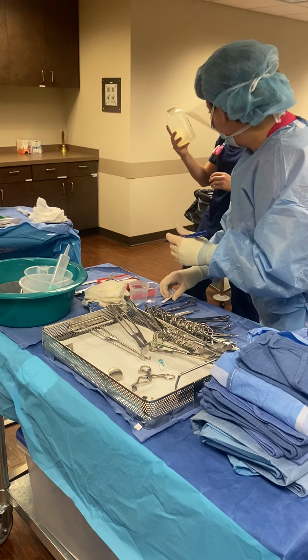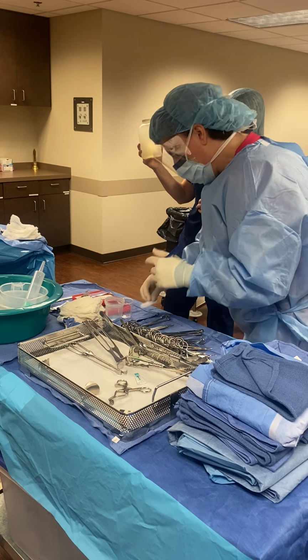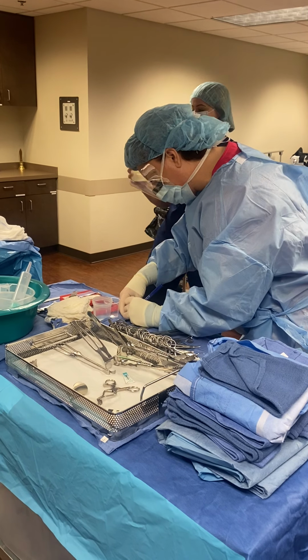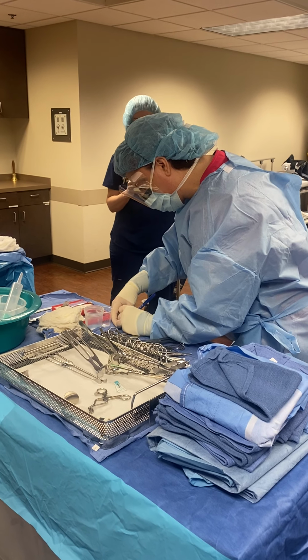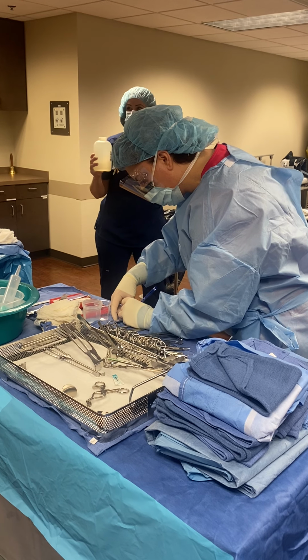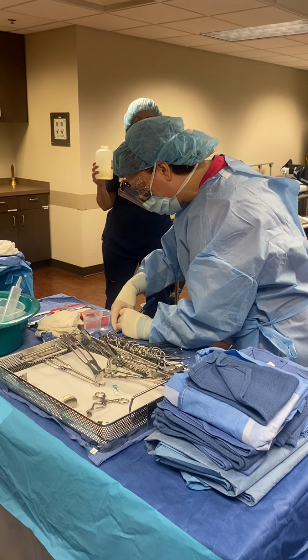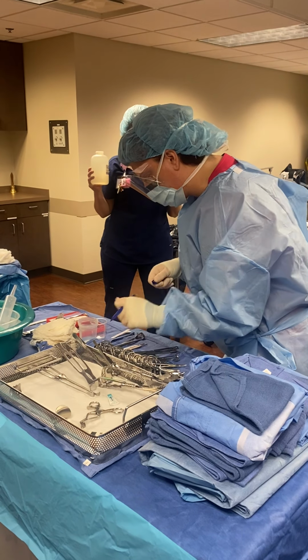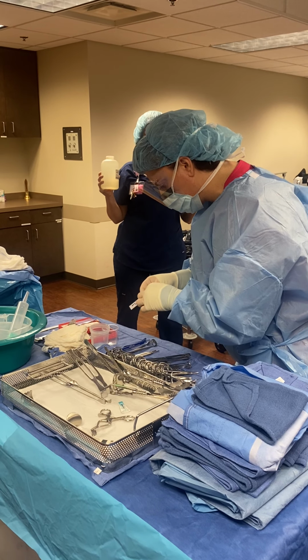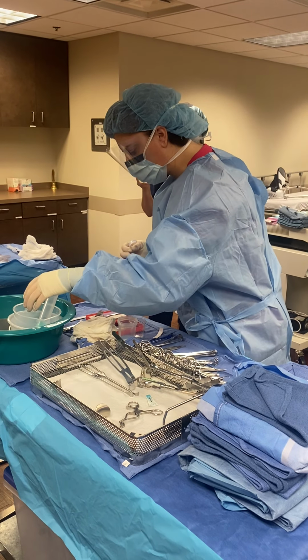All right, so for irrigation, we have sterile water, expires 10/25, and it is 1,000 milliliters. 1,000 mls of sterile water, 10/25. Why do you think we're using sterile water? This is my question from yesterday. What do we typically use to irrigate the wound with? Saline. And so why would we choose not to do that? Because of the implant? No. It's a breast biopsy, right?